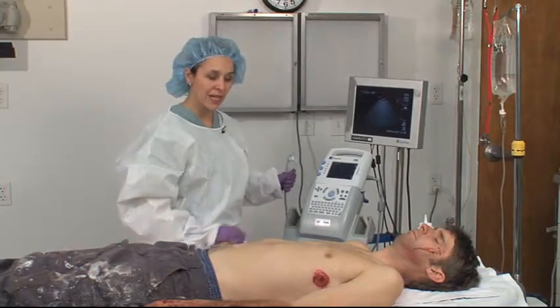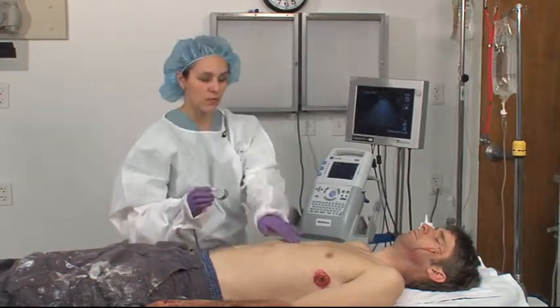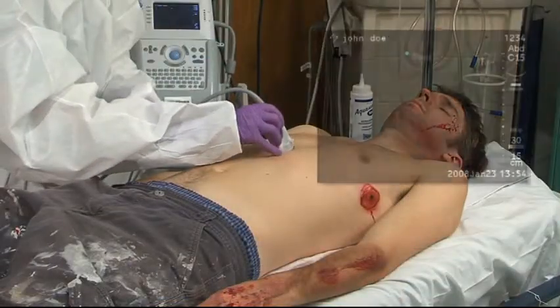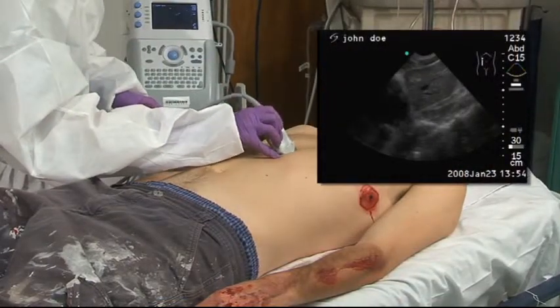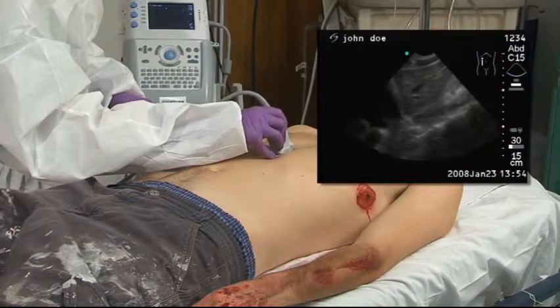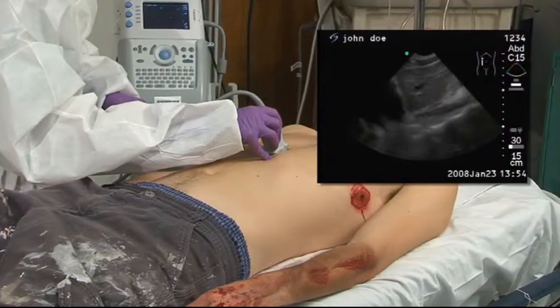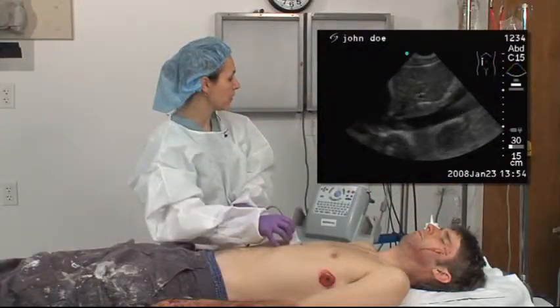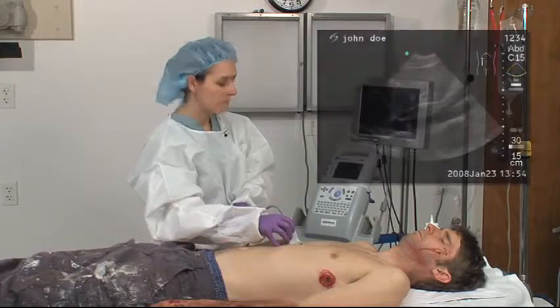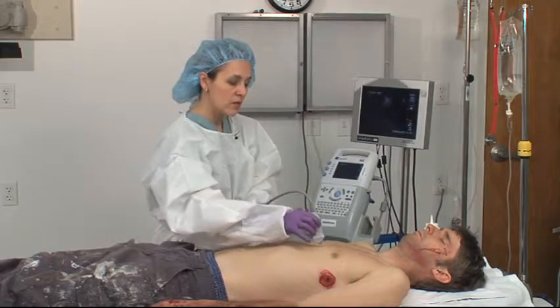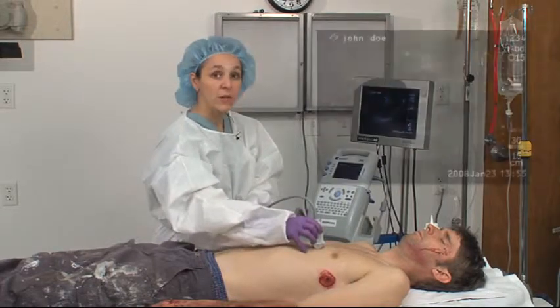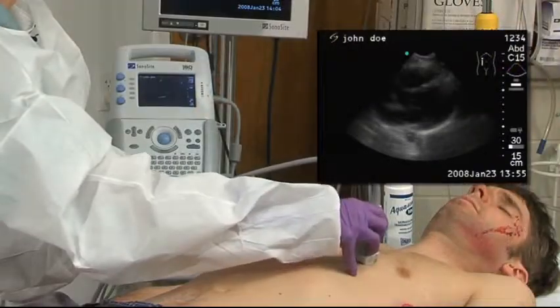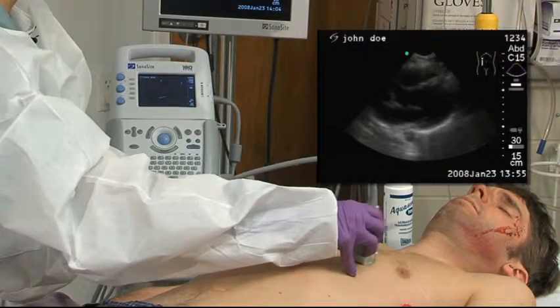The first location is the sub-xiphoid window, measured right at the xiphoid process, aiming up to get a good view of the cardiac shadow to eliminate the diagnosis of pericardial tamponade or pericardial effusion. An additional window may be used in the parasternal area to get an additional view of the heart as needed.